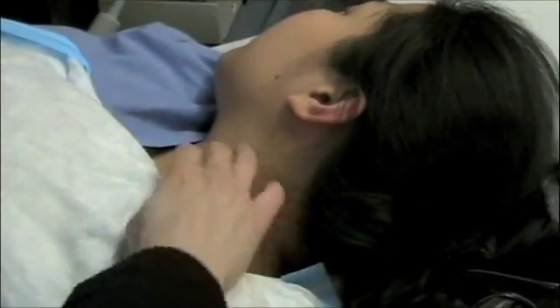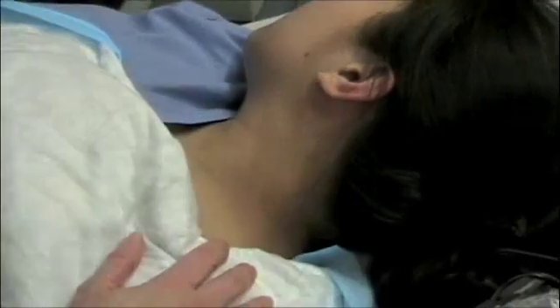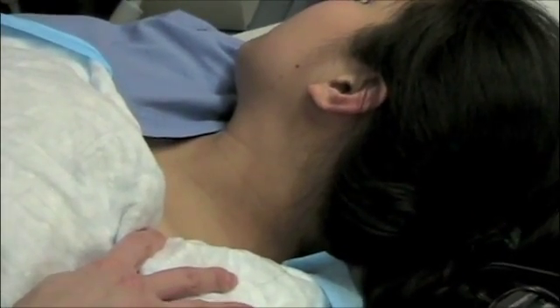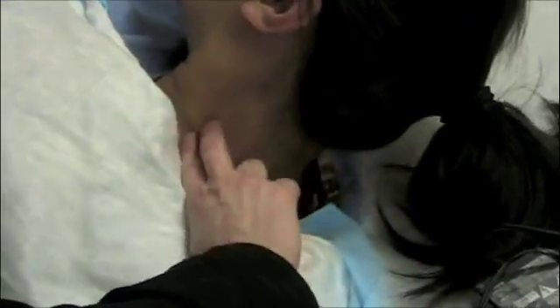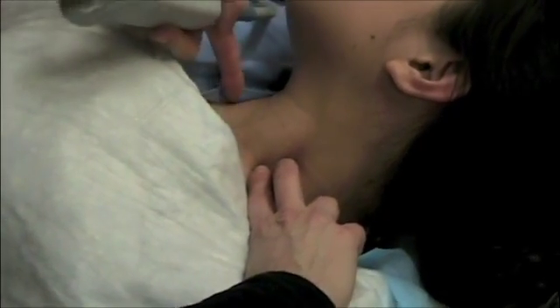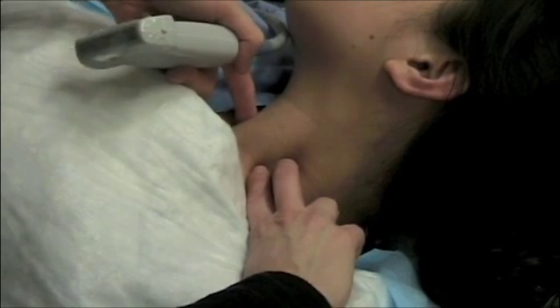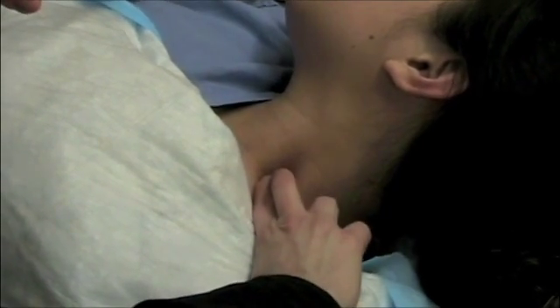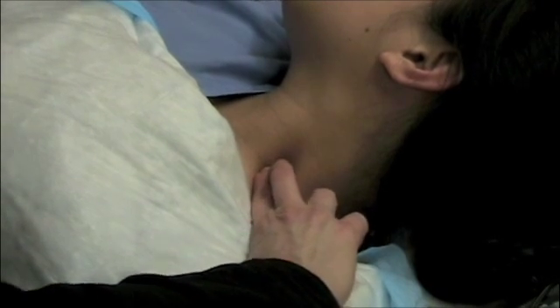We're going to show a scan on an actual person of what it looks like under ultrasound guidance. The interscalene groove is located between the anterior and middle scalene muscles. Have the patient lift their head up off the bed and palpate along the posterior border of the sternocleidomastoid. We typically do this block at the level of C6, at the cricoid cartilage. Once you slide your fingers back behind, you should feel the groove between the anterior and middle scalene muscles.